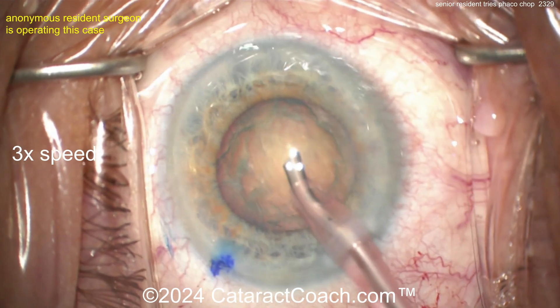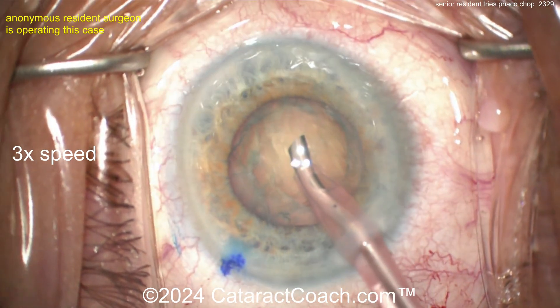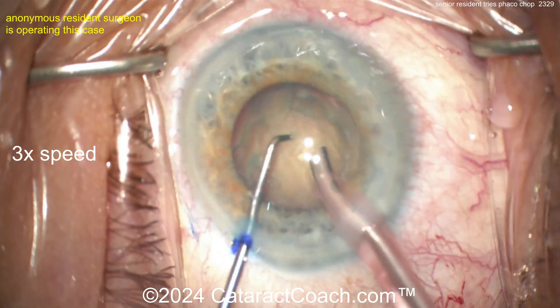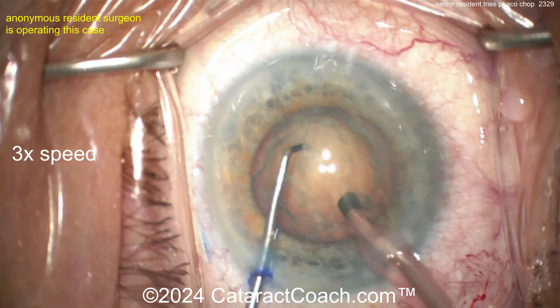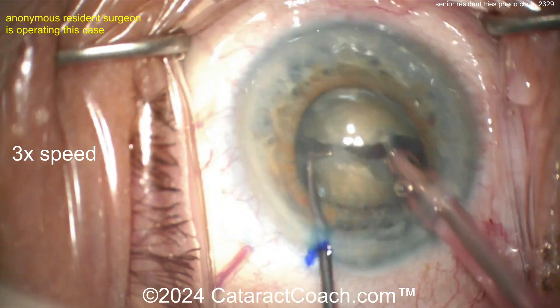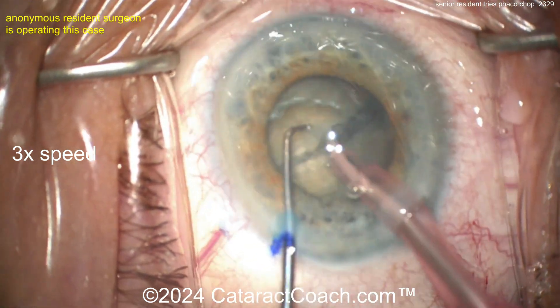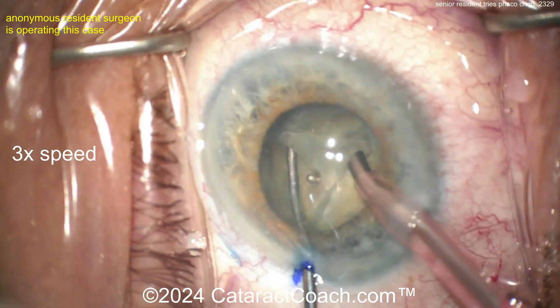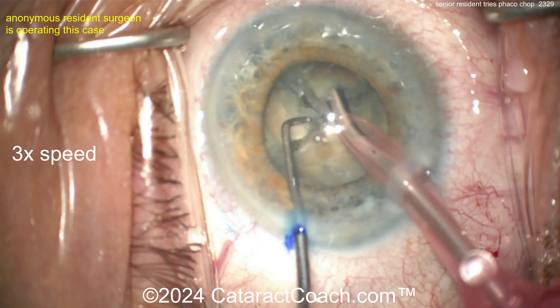I thought we were going to chop it — and here we go. Probably using high vacuum, high flow. Here's the chopper going inside the eye — looks like a horizontal chopper. And a fast chop there — nice horizontal chop. Look at that!